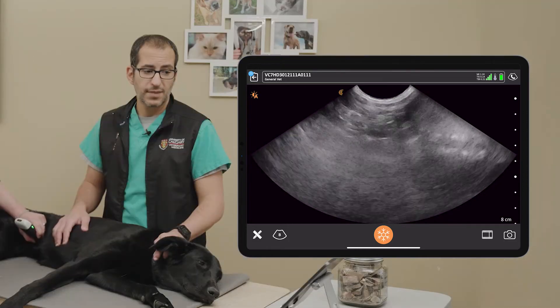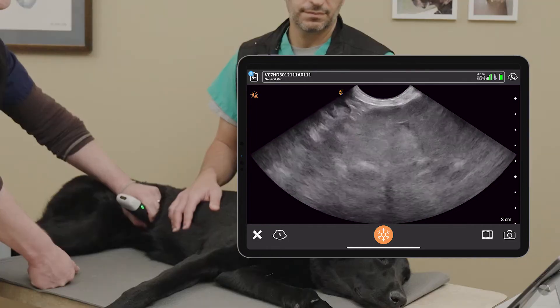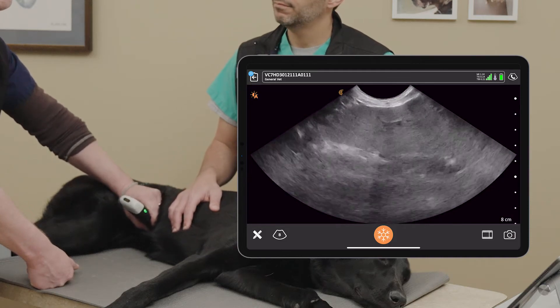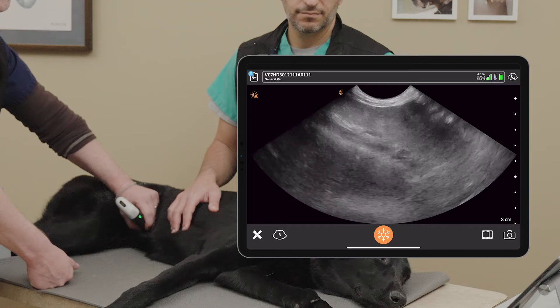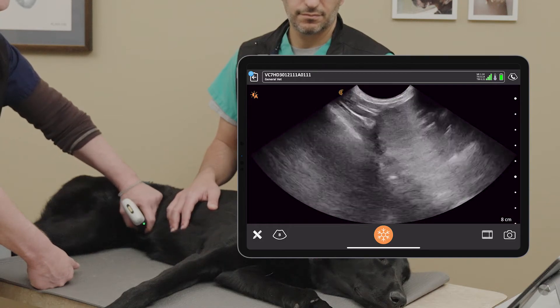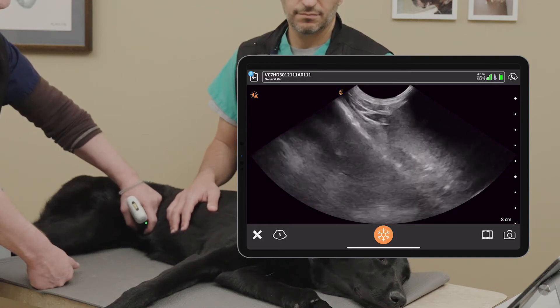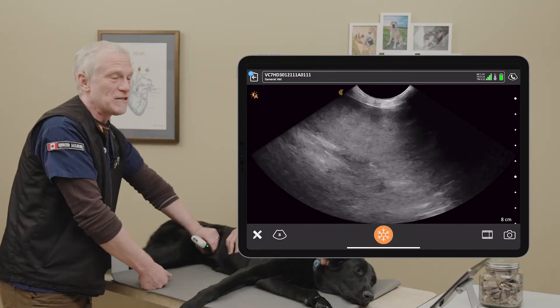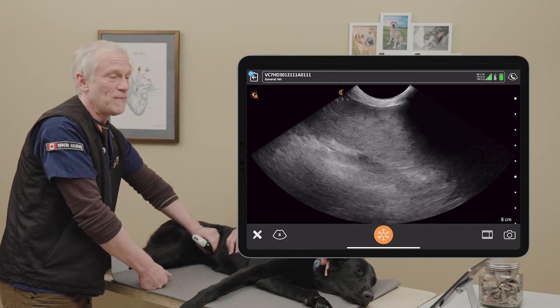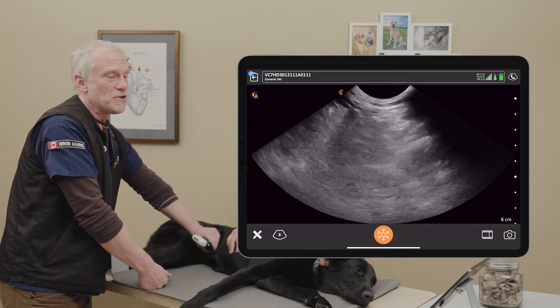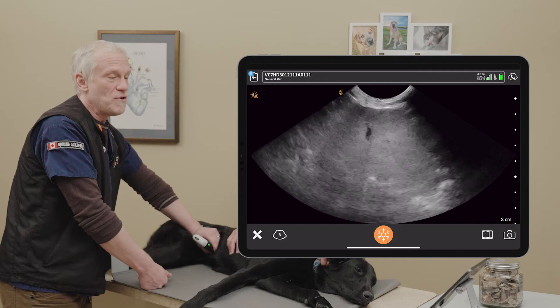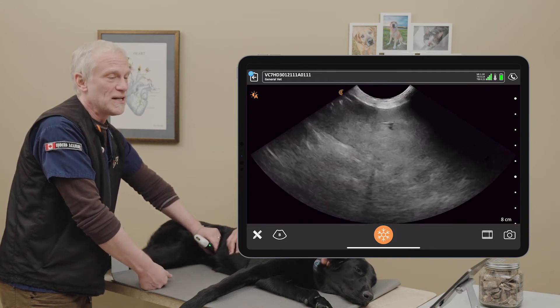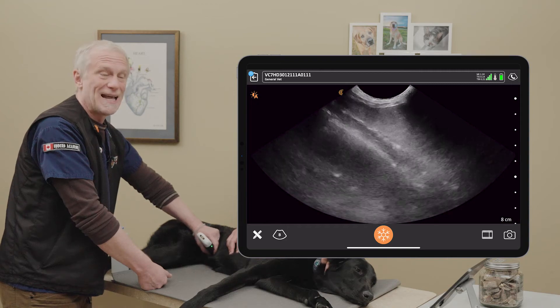The other thing we'll look for here, Dr. Schlubb, is going to be the spleen. And there you go — we can see the spleen now, and we can actually follow and trace it along very nicely. We can fan and sweep along that spleen looking for any obvious masses or abnormalities. Just like the intestine, we haven't done a lot of research to say non-specialists can identify intestinal foreign bodies or abnormalities beyond GI motility. We have not done any research to say what the accuracy of non-specialists is at identifying masses or lesions in the spleen, but the spleen is there and it is pretty easy for us to scan at this umbilical site.